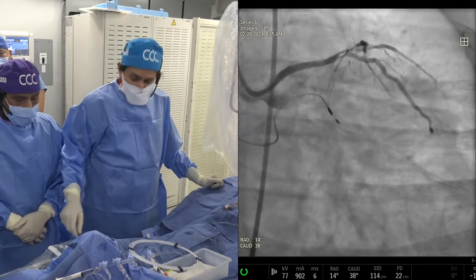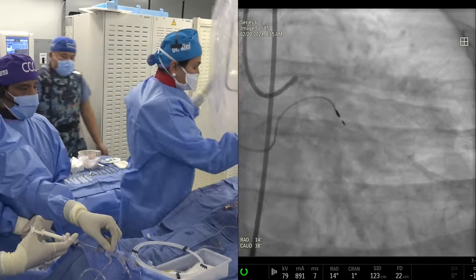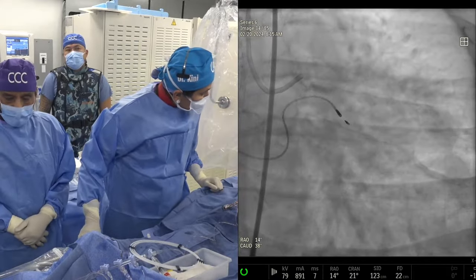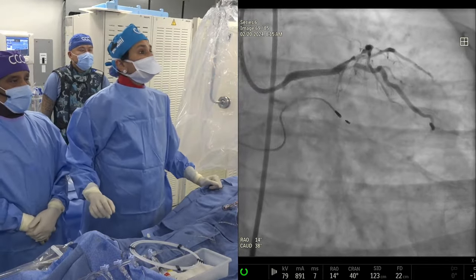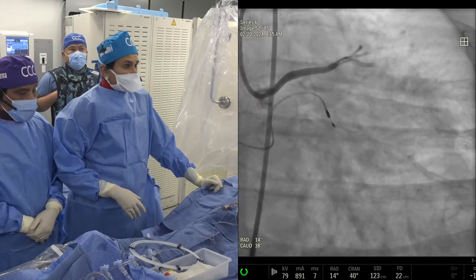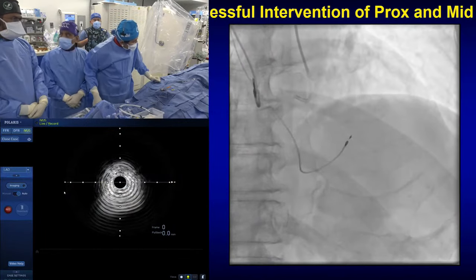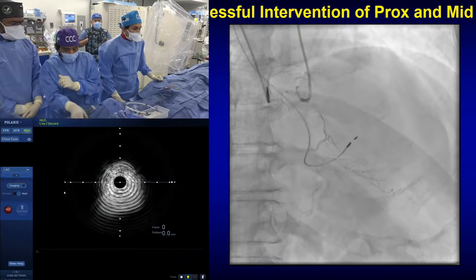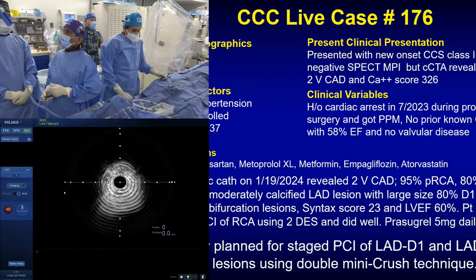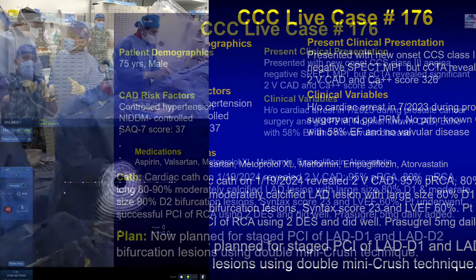Okay. So I think we should do the IVUS. Since IVUS is ready, and the patient's creatinine is okay, it could be OCT, but we are just going to do the quick IVUS to make the diagnosis of whether we need to do IVL or an atherectomy based on what degree of calcium this patient has. So let me just complete our presentation while we are planning. Go back to the slide presentation so that I can complete it.